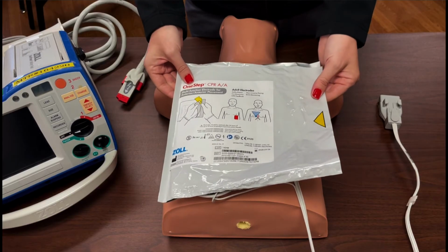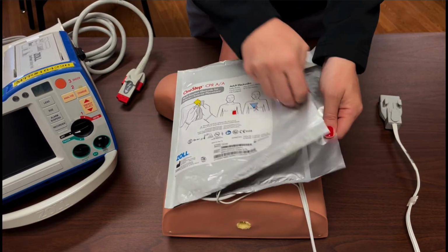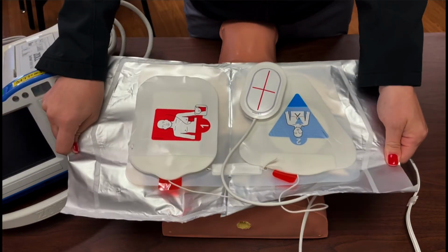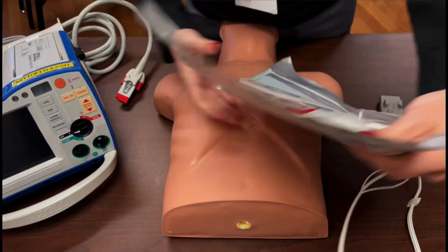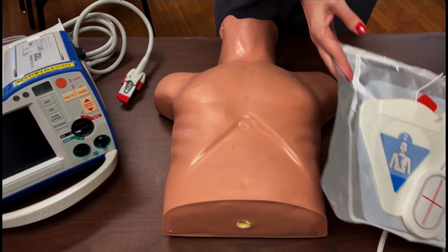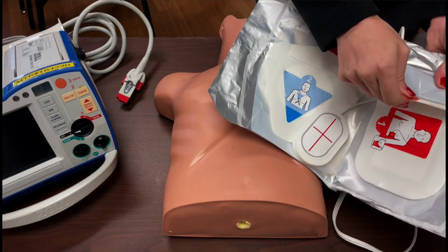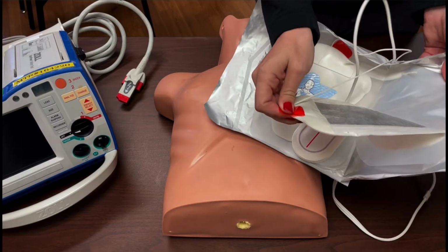So the way to open these pads, there is a yellow triangle here. You peel apart and then it opens up. You should see the two pads in place. To remove the pads, you're going to take the red tab and peel the pad off of the plastic.